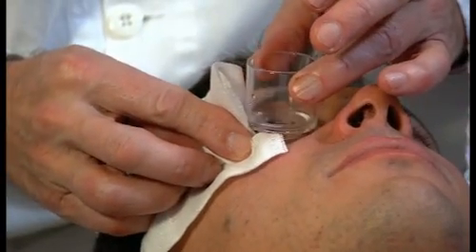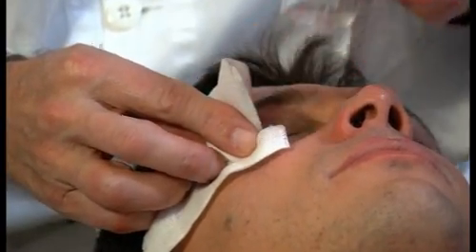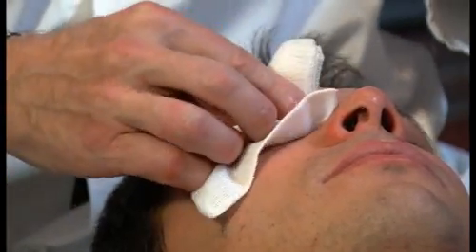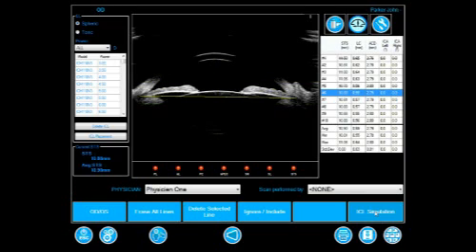The probe and then the shell are removed. The second part of the examination concerns the ICL simulation.